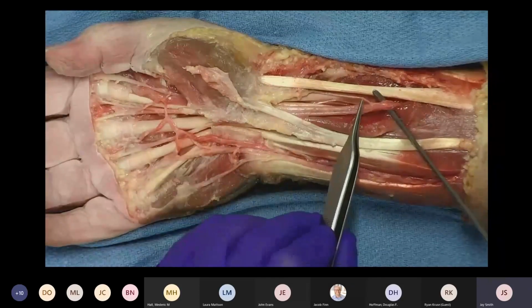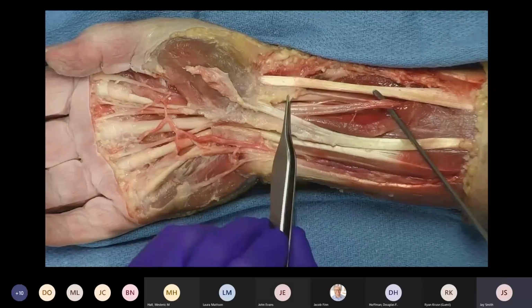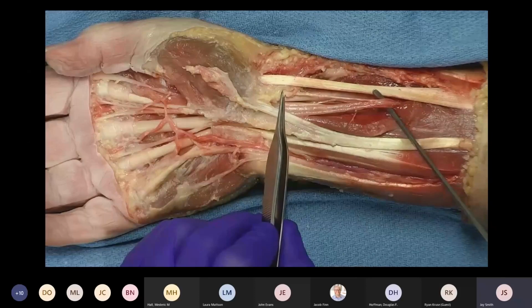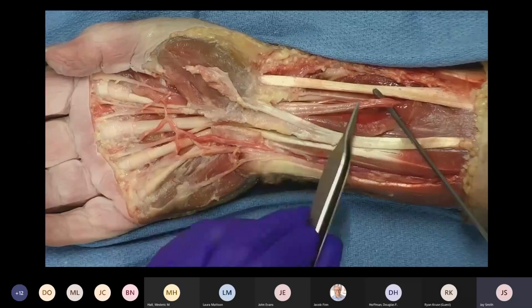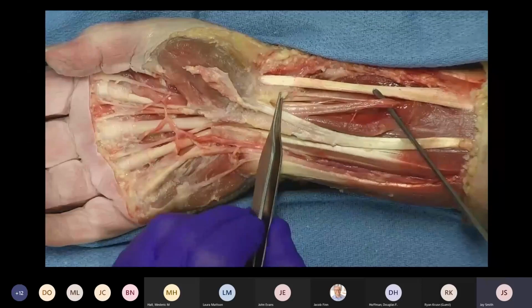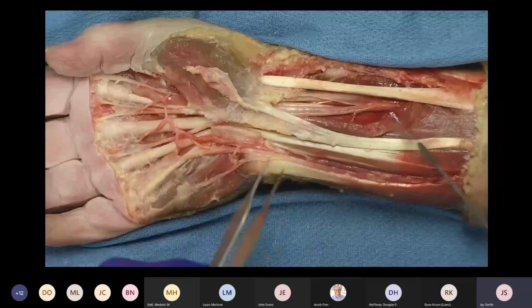So it originates on the radial side typically, will course next to the median nerve and then take off superficial and radial. It'll eventually penetrate the fascia, so it lies outside of the carpal tunnel, importantly, and then it will course next to or in the sheath of the flexor carpi radialis. So if you're going to try to find this nerve, you find it at its origin, or you find it next to the flexor carpi radialis at the level of the distal wrist crease. Very small. This person had one fascicle, but you can have multiple fascicles.